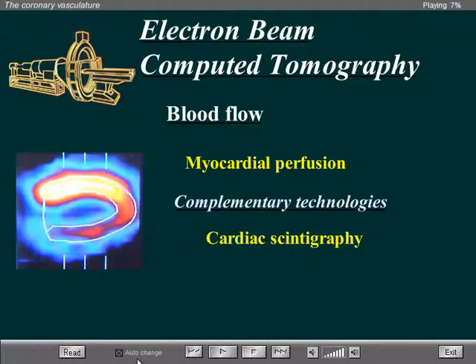Myocardial blood flow and myocardial perfusion can be predicted on the basis of scintigraphic examination, particularly SPECT studies, and lastly, myocardial tagging using cine magnetic resonance imaging can also correlate with regional myocardial blood flow perfusion abnormalities.